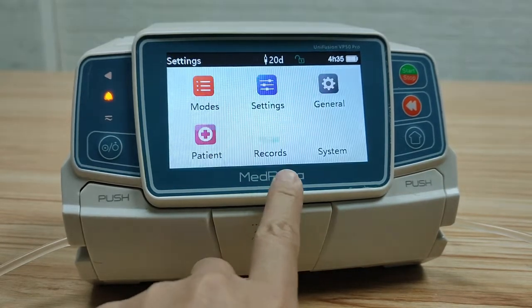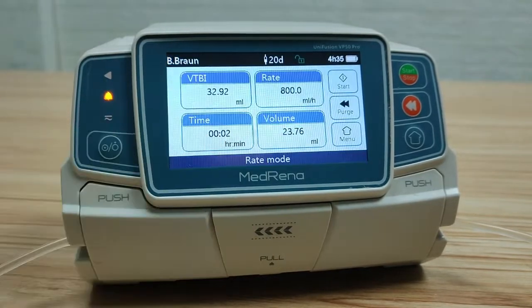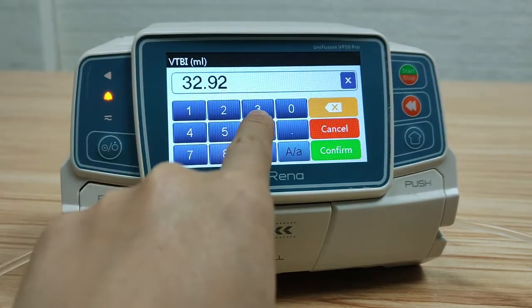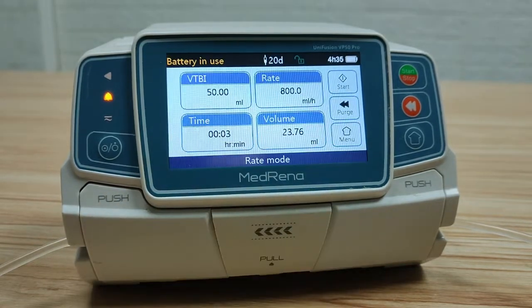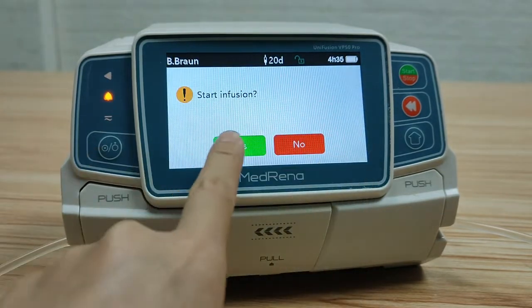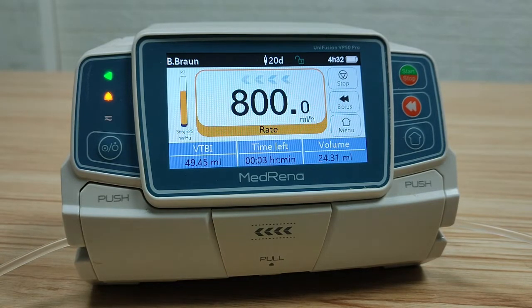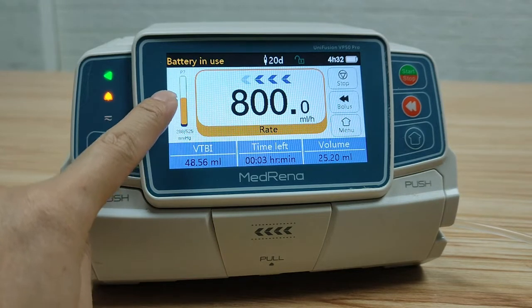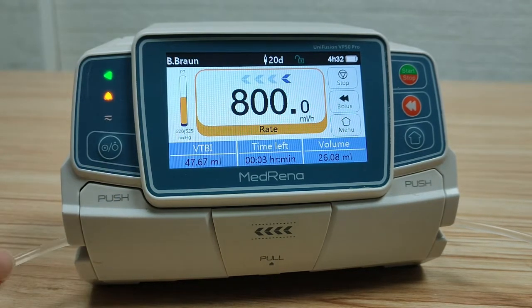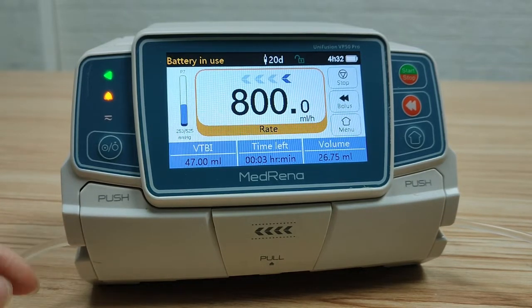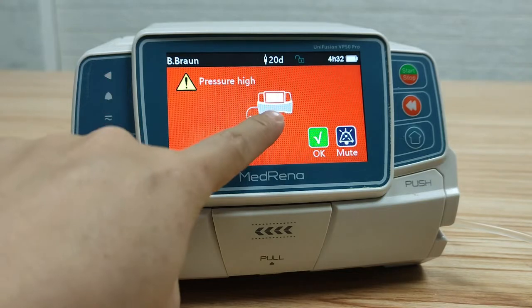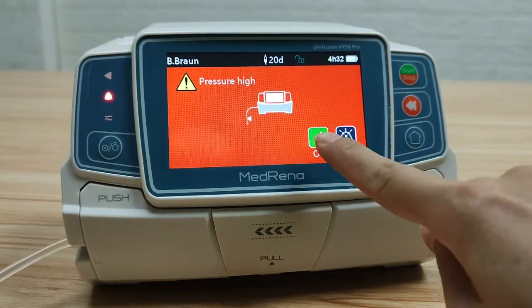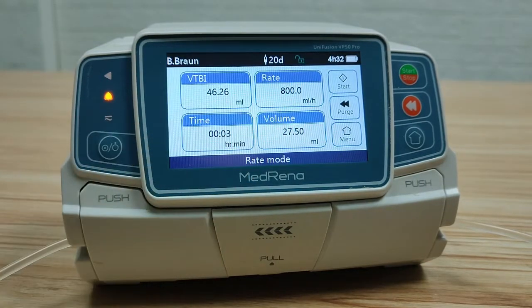Let's check it now. Turn to the infusion mode page, select rate mode, set VTBI and rate, then start infusion. We can see the dynamic pressure status from the pressure bar on the screen. Now we press the infusion line to simulate an occlusion — the pump prompts an alarm and the infusion stops. Press OK, go back to infusion mode, and we can restart the infusion. This is how the DPS function works.